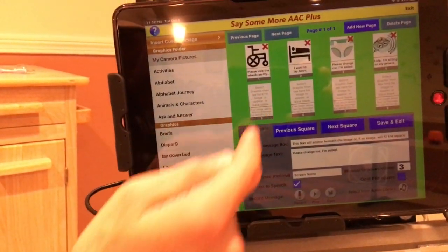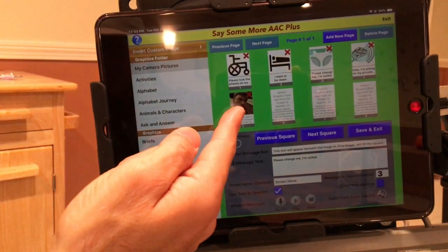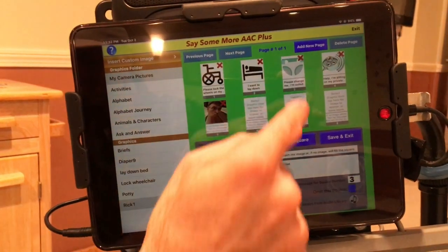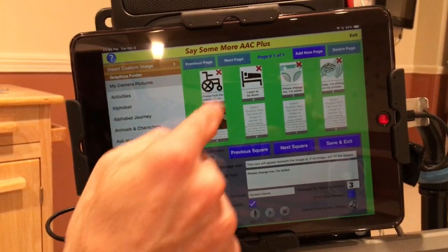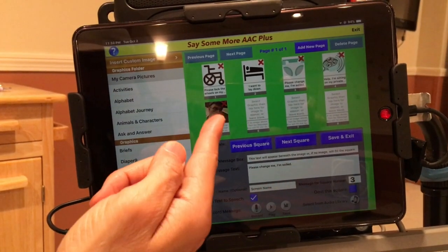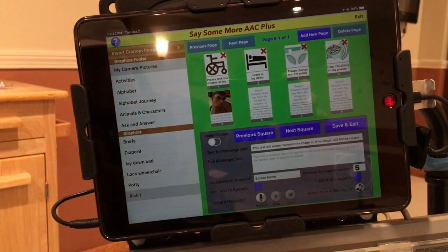Now if we're making new custom speech, we're gonna do this one. And now that's how it appears. We got the new icon here. But 3 is still selected. That means this is the text for 3. We were able to put an icon in 5, but in order to actually edit 5, we have to go to 5. Now we're in 5.